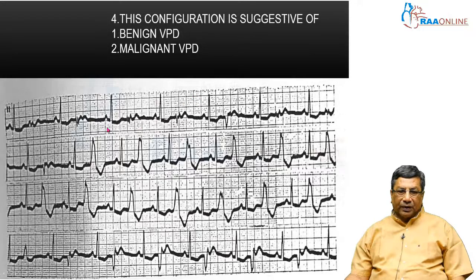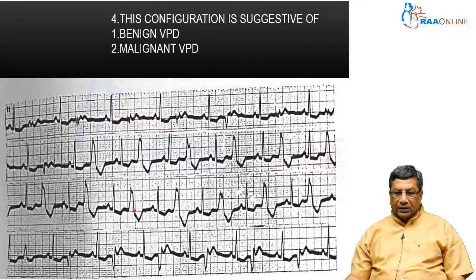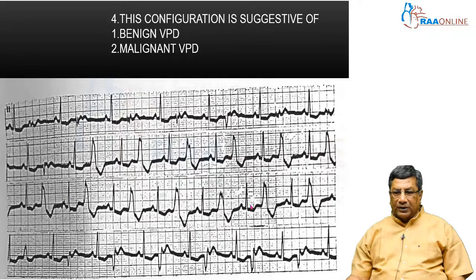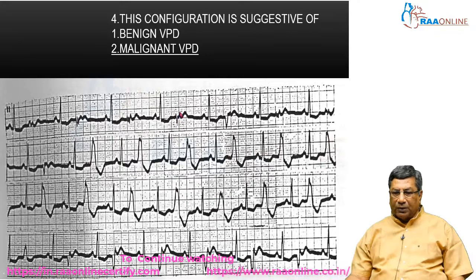Now we have shown you the configuration. We are looking at the configuration of the VPDs. The VPDs are wide, and you have multiple notches — you can see the multiple notches there. This configuration of the VPDs is suggestive of a malignant VPD, because you can see very small multiple notches in the VPDs. Small, broad VPDs are malignant.